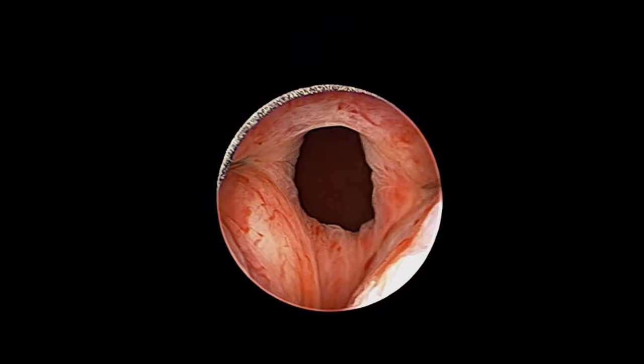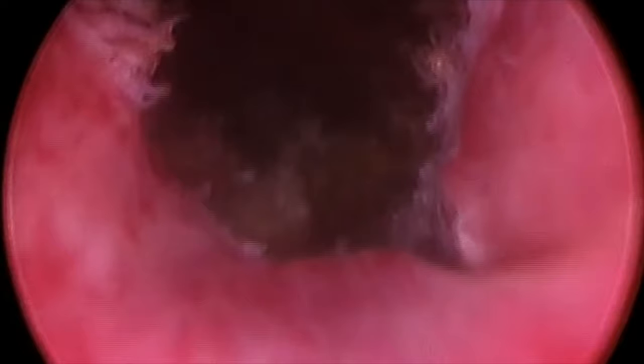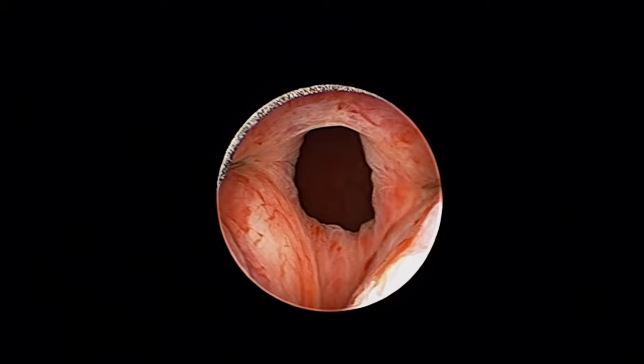It's a bit unfair to compare these pictures side by side because they're not from the same patient, but you get the idea. I can get your prostate completely open with a green light procedure, and if you want the maximum possible result, then go with a green light. However, if you want something minimally invasive that also opens up the prostate significantly, then go with Urolift. Of course, if you get a Urolift and are not satisfied with your results, you can always then get a green light or TURP done.